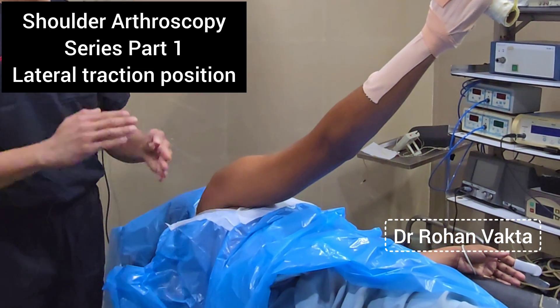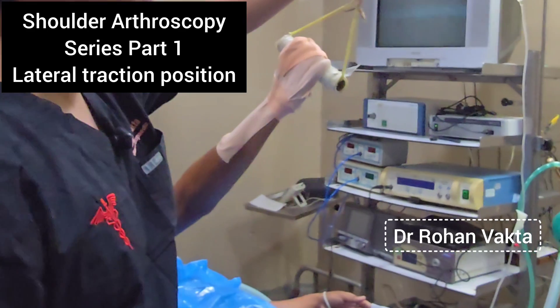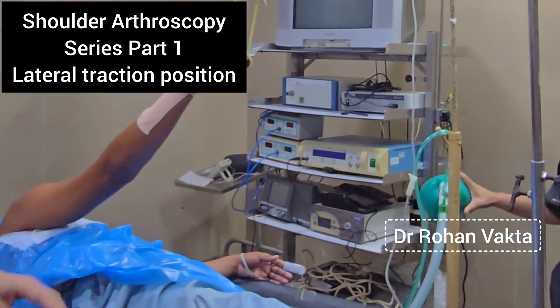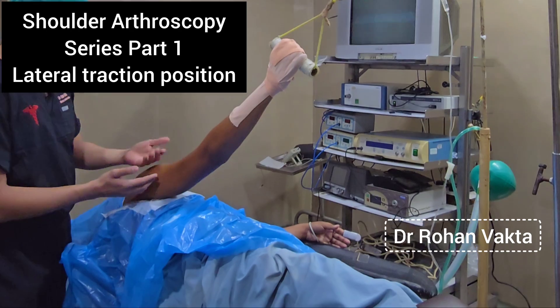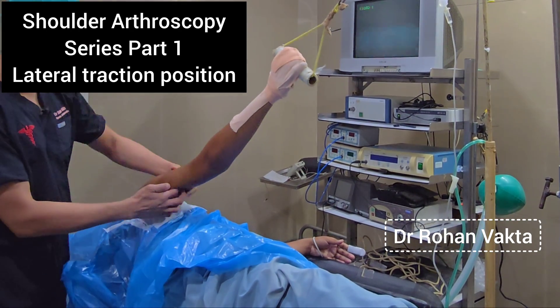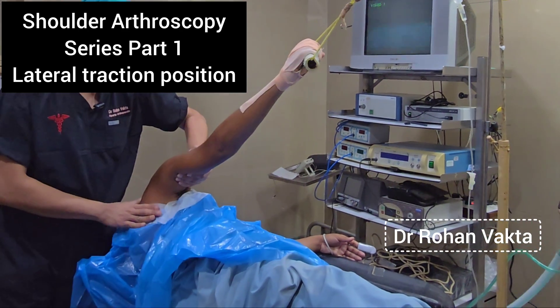If you keep the body dead lateral, entering the joint becomes difficult. The advantage of this device is it can be attached to any table, so it is easily portable. The only disadvantage is that along with the axial traction there is no glenohumeral distraction. You can use a gamgee pad here, or your assistant can give manual traction while doing the bankart repair.